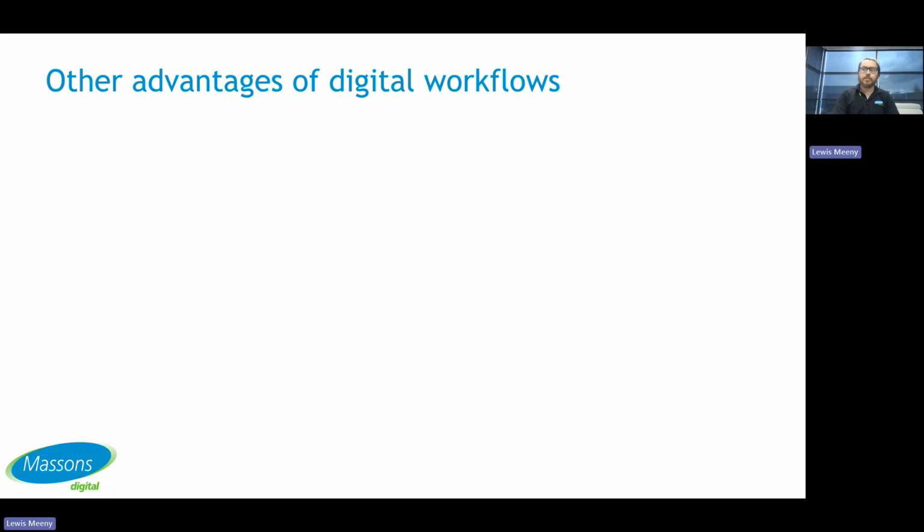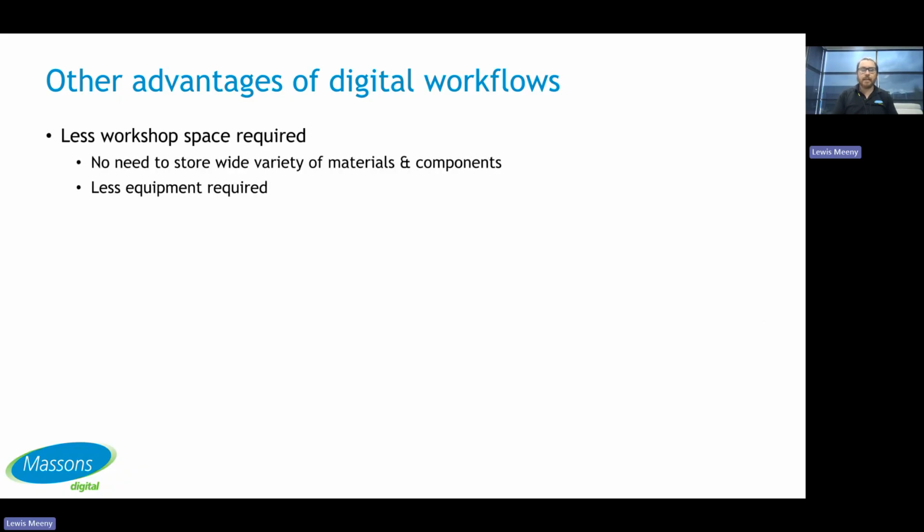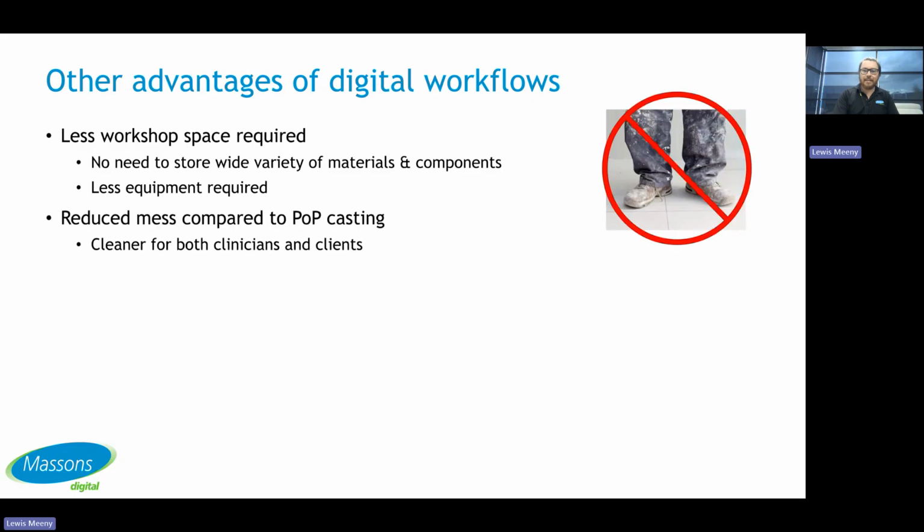Some other advantages of a digital workflow, well, ideally, less workshop space. If you're doing a digital workflow, you don't need to store as much on site and you don't need as much equipment, especially if you're utilizing central fabrication. One great benefit is if you like having nice shoes or nice pants, wear them to work because they're not going to be covered in plaster anymore. So that's cleaner not just for yourself, but also for clients, especially if we're using more fiberglass in cases of casting rather than plaster.